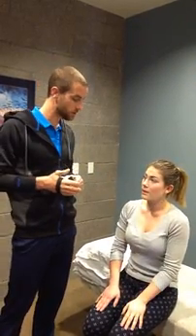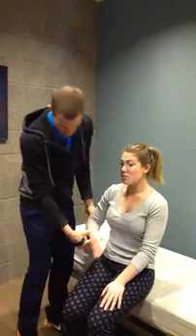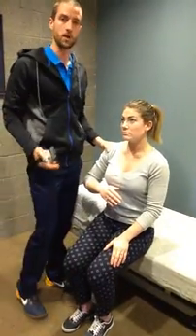So for the shoulder, we're going to test our rotator cuff muscles and shoulder blade muscles. So we're going to do some of them in sitting and some of them in prone. So the first ones we're going to do, infraspinatus and teres minor. First they should all be sitting, they should have their feet on the ground, they should be nice and square, decent posture.